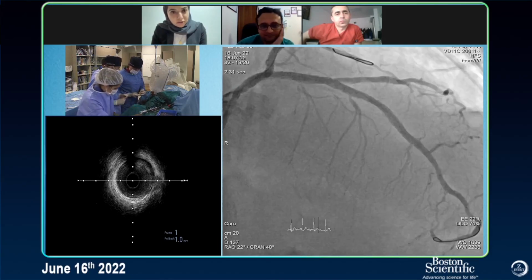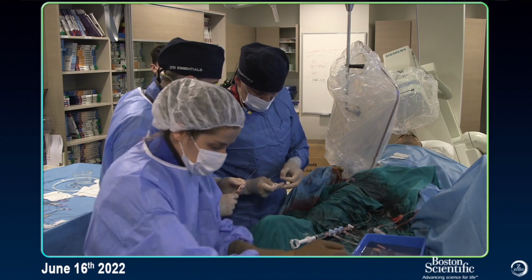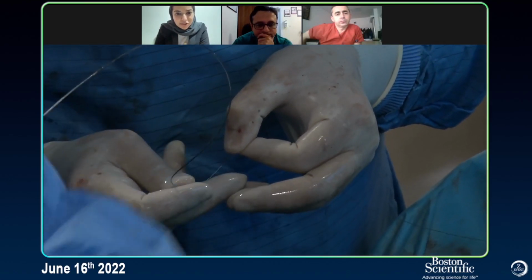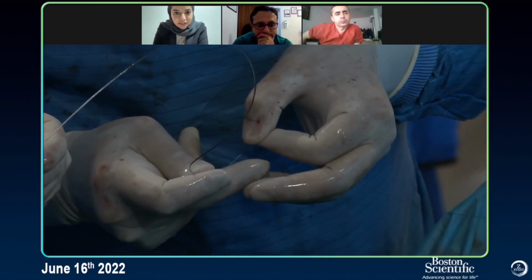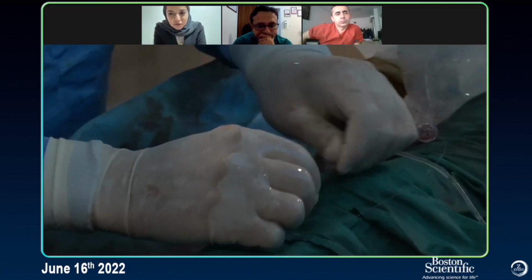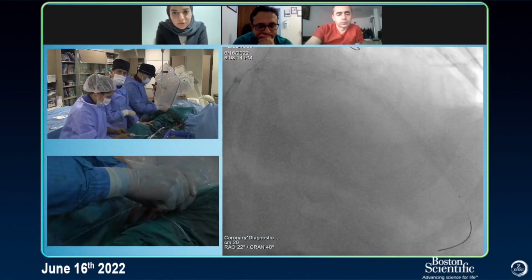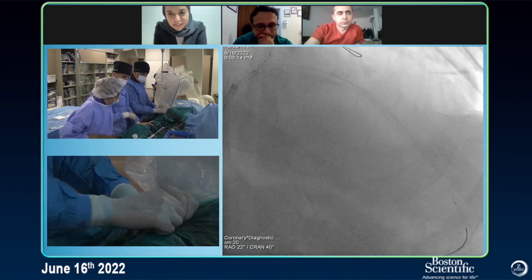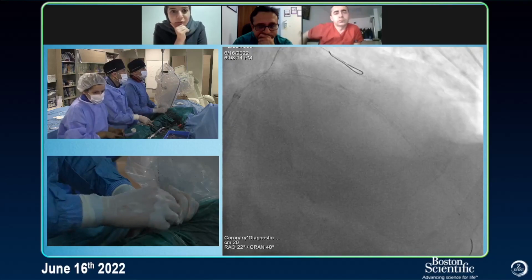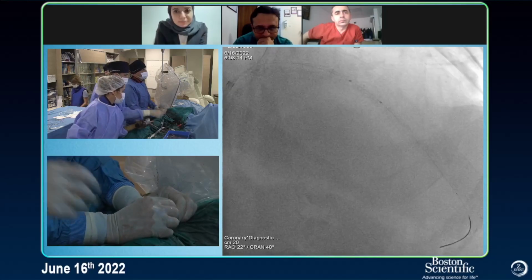I think in general, first of all, you did a really great job. It's really tough lesions throughout the LAD. Great job handling the complication, and you've demonstrated all tools in terms of the calcium modification and how you handled it very well. These things sometimes, as you mentioned, you would see an area that's underexpanded, or in this case, the stent itself expanded to 3.0. It's just the calcium on the one side. So hitting it one more time, maybe with an NC. If you already have an MSA of greater than 5.5, I think you leave it as is. Let us see.